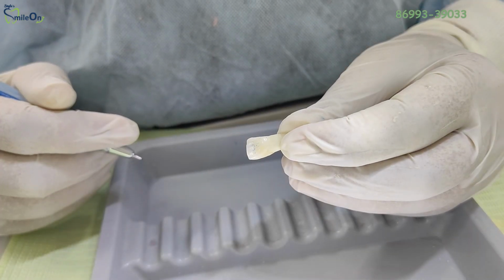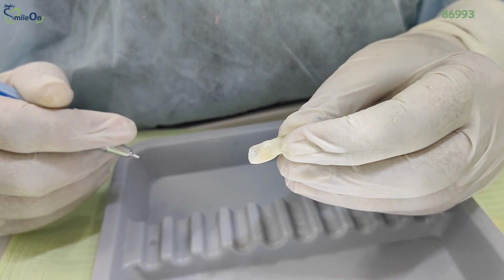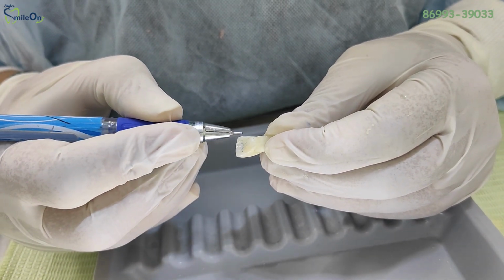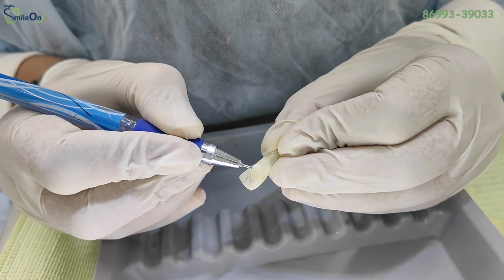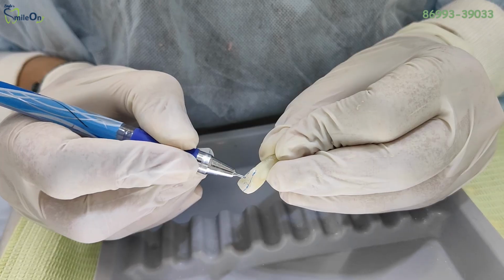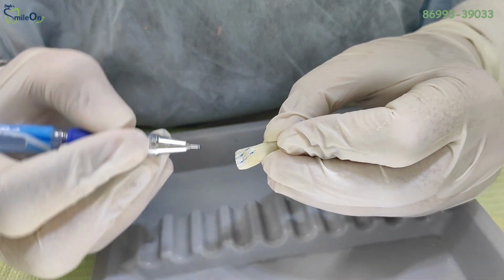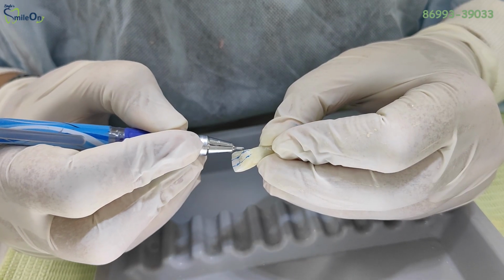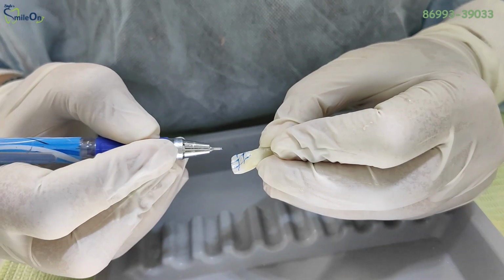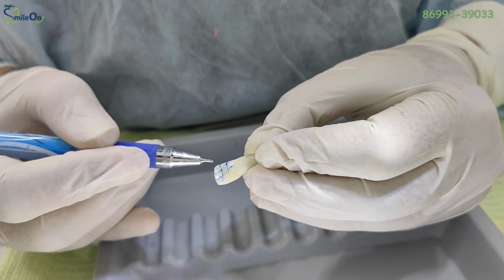Now for the access, we have to divide the tooth vertically as well as horizontally. First we have to divide the crown portion vertically in three parts. We have to make two lines and divide the tooth in three parts. Same way we have to divide the tooth horizontally. So this way, as you can see, we have divided the crown portion and made a grid.